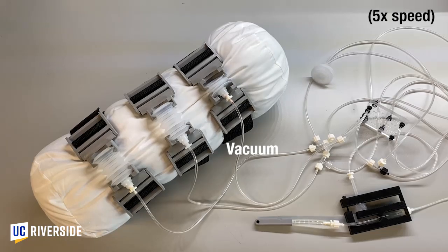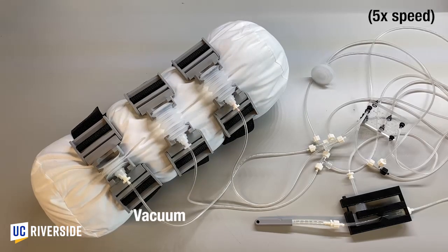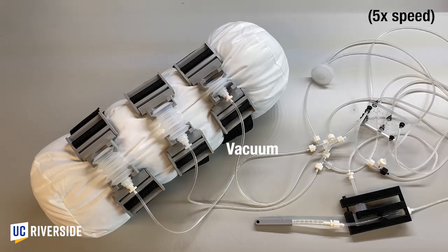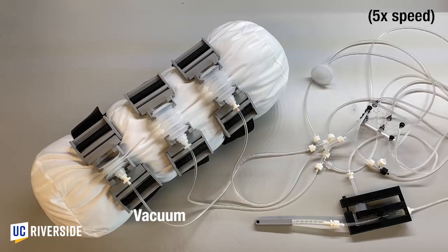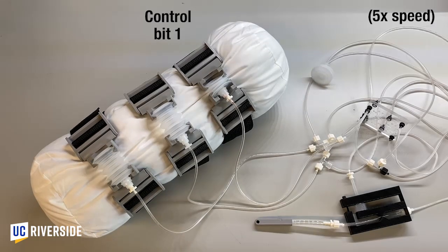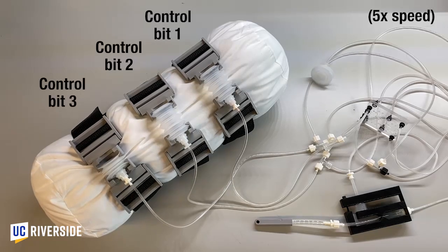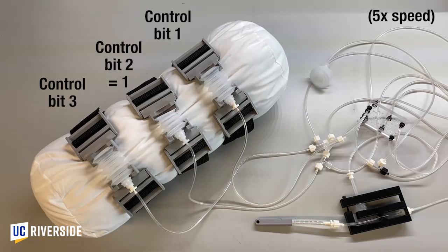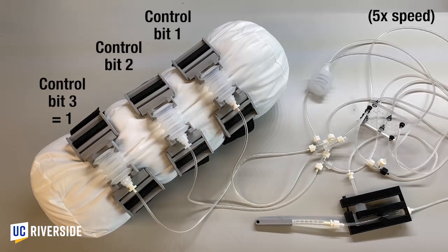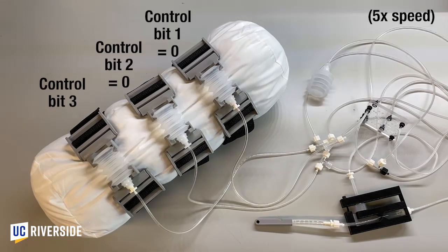When a vacuum is applied, the bellows contract and squeeze the leg. When the vacuum is removed and atmospheric pressure is applied, the bellows expand and release the leg. Let's refer to the pneumatic signals that power these bellows as control bit 1, control bit 2, and control bit 3. When a bellows is receiving vacuum, that represents a value of 1 or true for that bit. When a bellows is at atmospheric pressure, its bit is 0 or false.